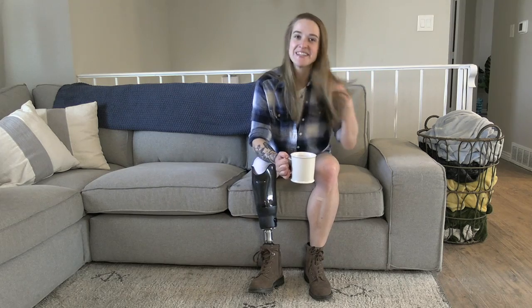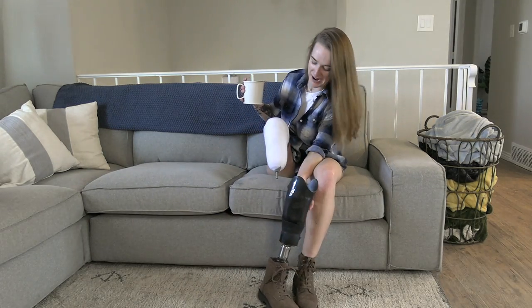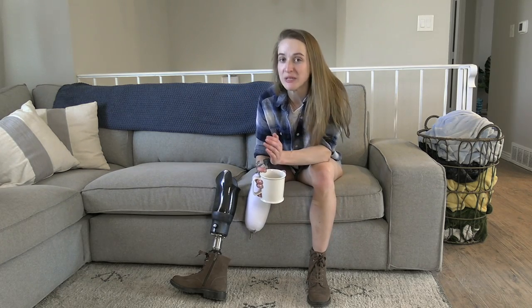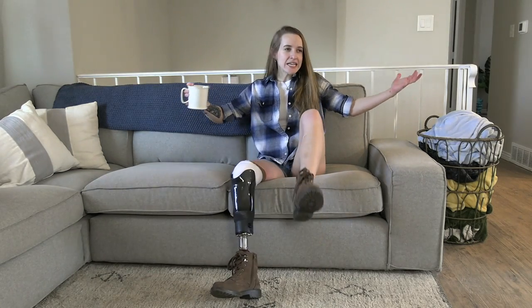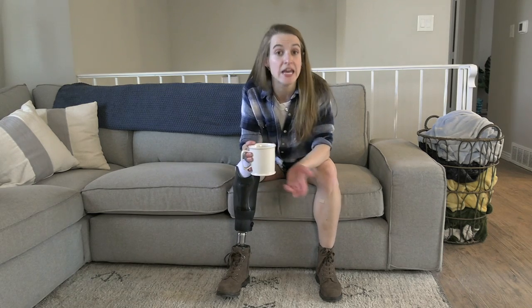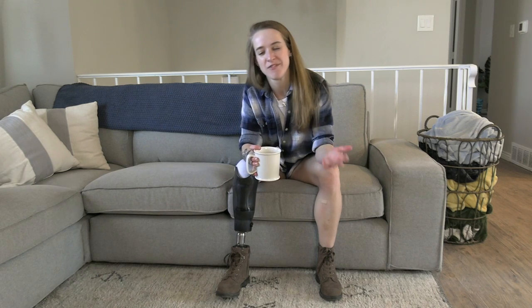But it's now a couple days after I got this pinlock socket. There are some major benefits of this that I'm really excited about because honestly, in so many ways, it really is just the little things. Unfortunately, the pain is not any different, at least so far. And when you get a new socket, there are always gonna be modifications that need to be made as you have it for a few days and figure out what it feels like, if there are painful spots.